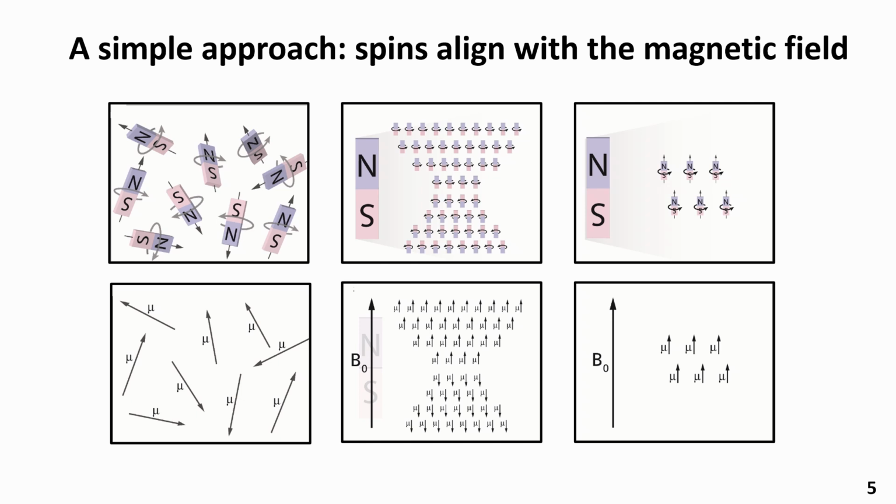Here you see the resulting picture after canceling out the spins pointing up with those pointing down. The remaining 6 in a million spins are the source of the magnetic resonance signal. These are the ones that will make imaging possible.